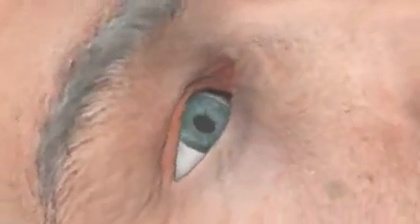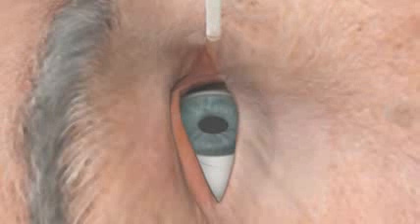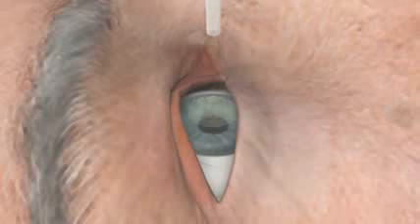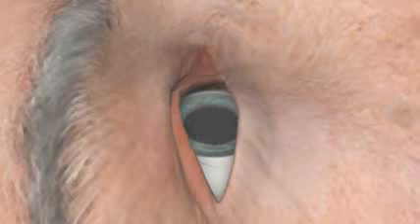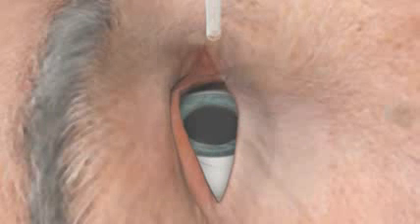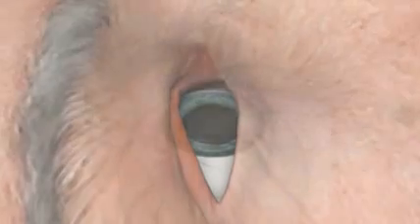Once your ophthalmic surgeon has examined you, drops will be placed in your eye to dilate or widen your pupil. This makes it easier for the surgeon to see the lens of your eye. Local anaesthetic drops will be placed in your eye to completely numb it. Sometimes a local anaesthetic injection is used instead of drops.